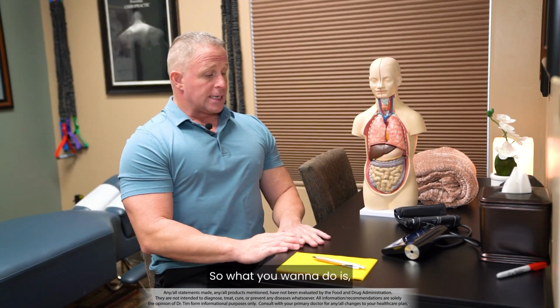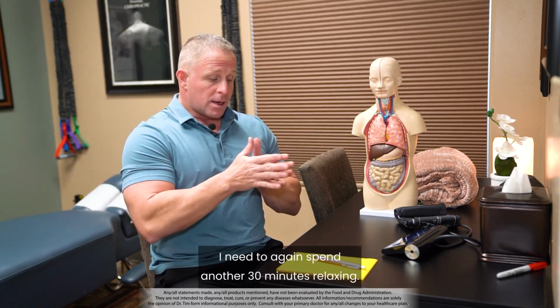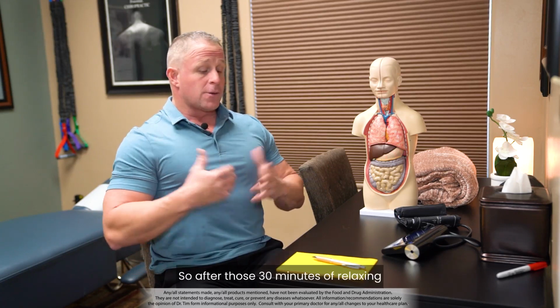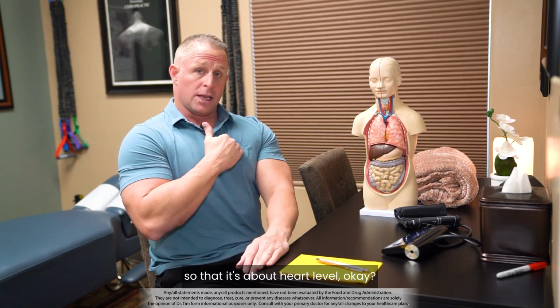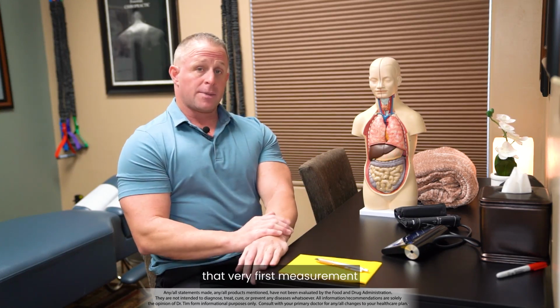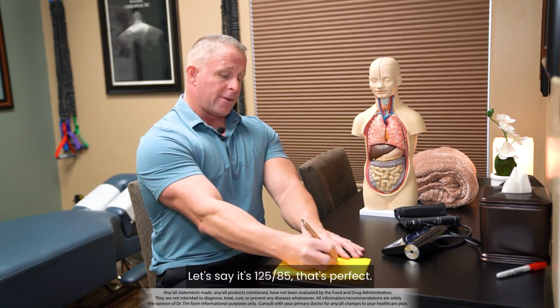So what you wanna do is after you've been sitting and relaxing for 30 minutes only. Now, if I get up and go to the bathroom, 20 minutes into it, when I come and sit back down, I need to, again, spend another 30 minutes relaxing. So you have to start over, okay? So after those 30 minutes of relaxing, I'm gonna put the blood pressure cuff on my arm, maybe put a pillow on your lap so that you can have your arm kind of resting up like this so that it's about heart level, okay? So when you have the cuff on, 30 minutes later, we take one measurement. That very first measurement, I'm gonna write it down. Let's say it's 125/85. That's perfect.